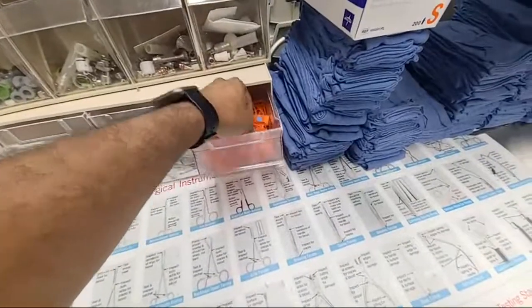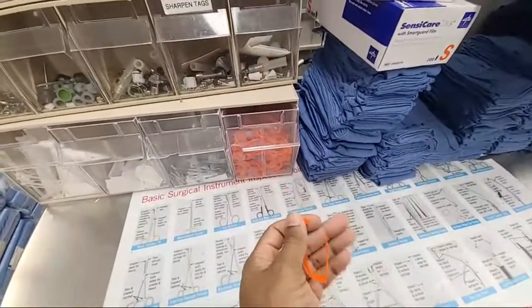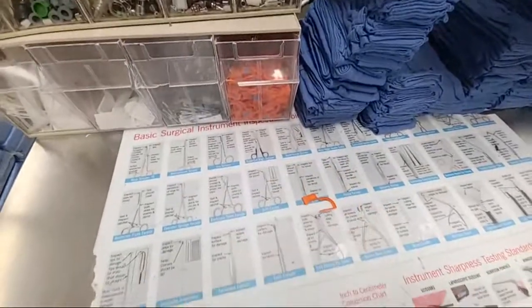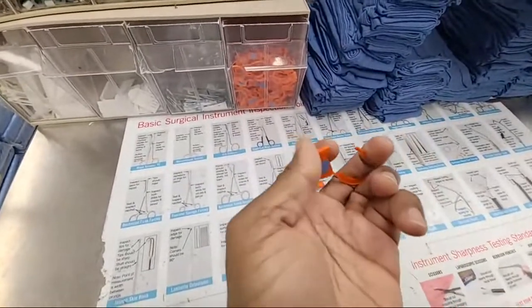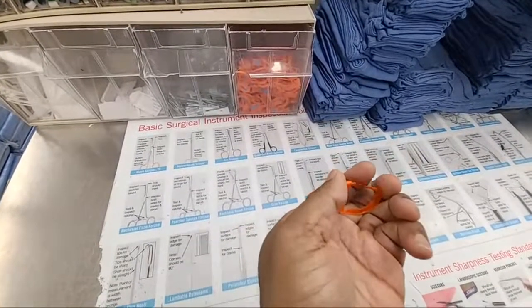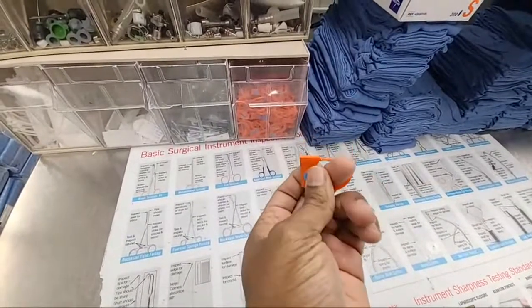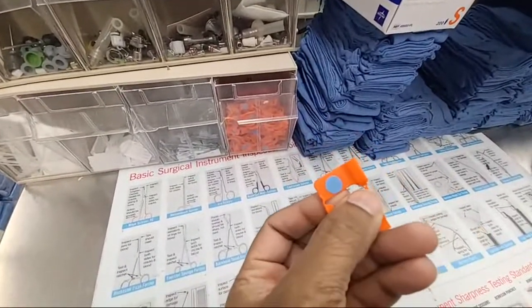On the rigid containers, we use these tamper evidence locks. So they close like this. Can I do this one-handed? Go like this. Oh yeah. It's kind of like a zip tie, if you've ever played with a zip tie. So they lock like that, but it's so thin right here.